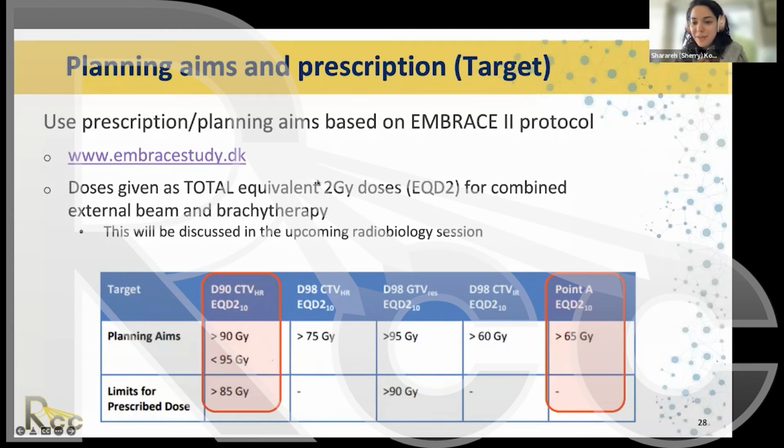Dr. Brown, we also have a question before we dive back into the constraints. What do you think about the CT plan orientation, axial or paraxial, or you don't find a value and there's no difference between the two types of images? Between using the different planes? Yes. Yeah, I think you need to use axial, paraxial, all of the planes. I think you need to use them all. They're all equally valuable and they're all equally important, and you really need to use them all.